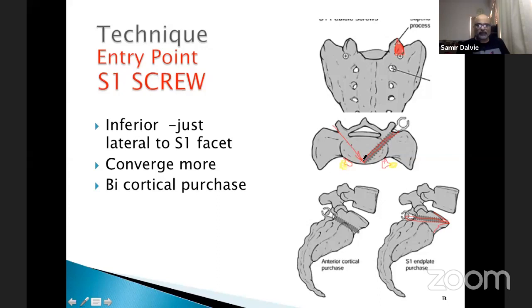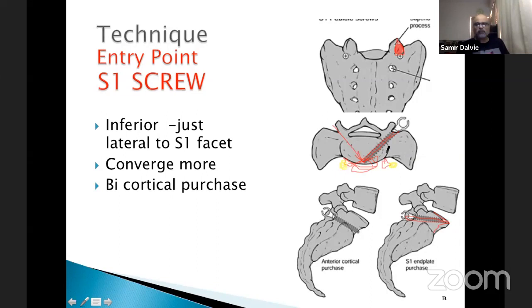After confirming anterior cortex perforation, the entire length of the tract must be tapped — including the far cortex — using a 5 mm tap for a 6 mm screw. Failing to tap the anterior cortex causes the screw to spin in place, cutting out the threads and creating a 'GFR screw' (gears free rotating). This necessitates a larger, longer screw and creates a significant intraoperative problem. The rescue option of an ala screw exists but Dr. Dalvi has never personally used it.